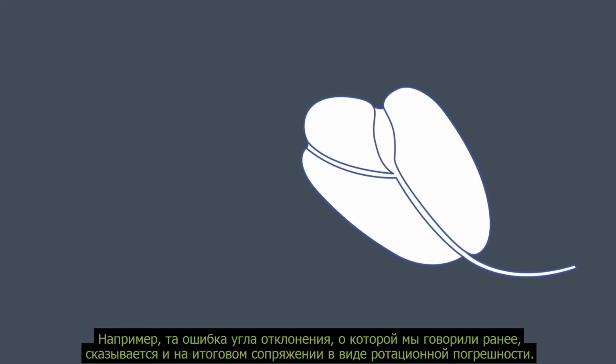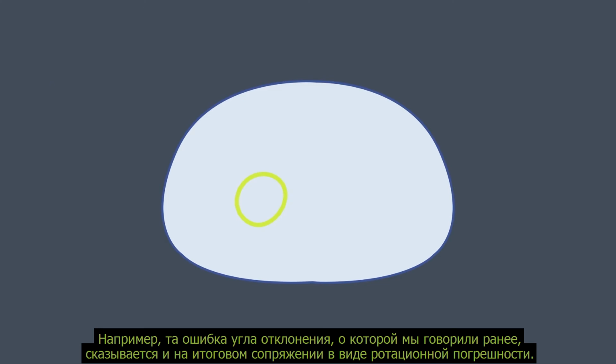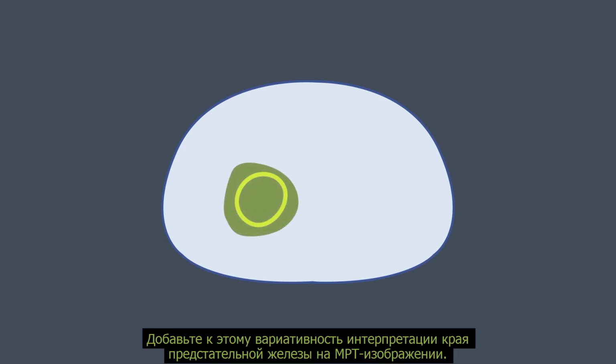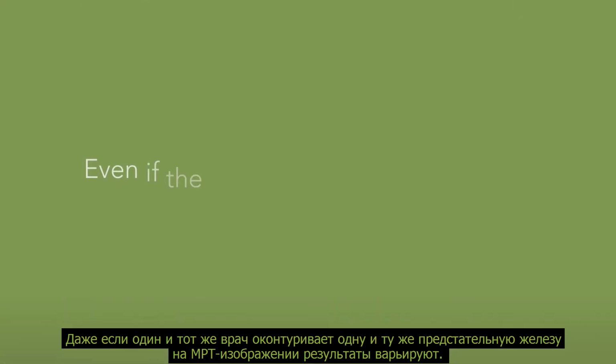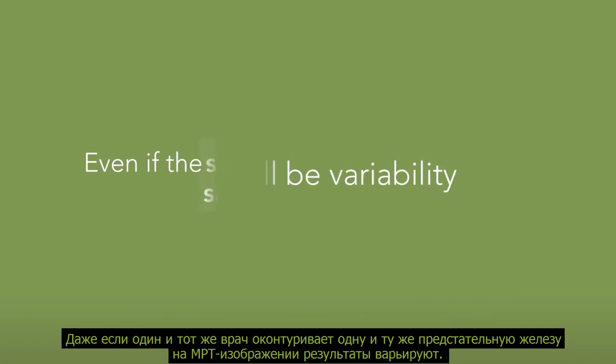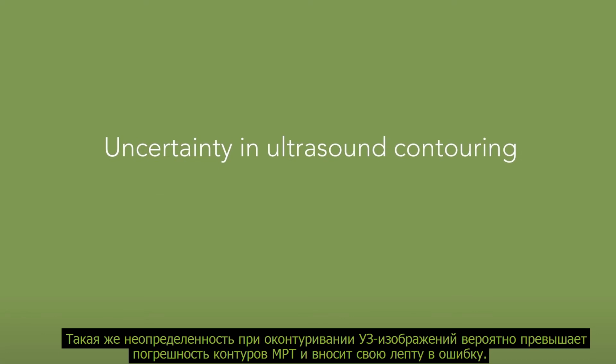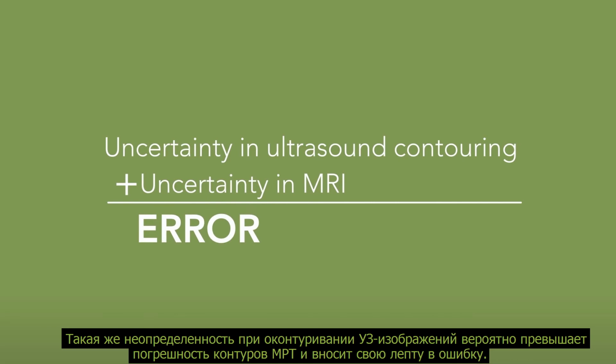For example, that rotational error that we talked about before will get baked into the final registration, resulting in rotational uncertainty. Add to that the variability in MRI prostate capsule interpretation. Even if the same physician contours the same prostate on the MRI, there will be variability. The same uncertainty in ultrasound contouring likely exceeds the uncertainty in MRI and adds to the error.